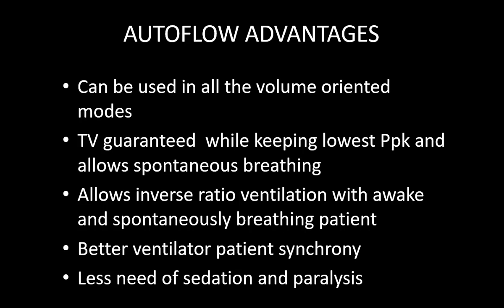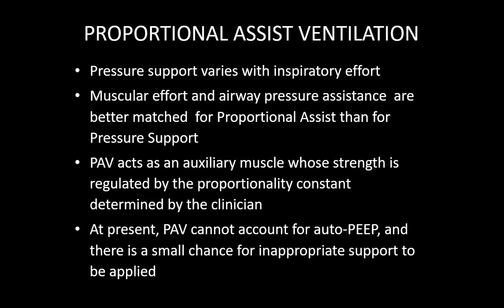So it can be used in all volume oriented breaths, tidal volume guaranteed while keeping the lowest peak pressure. It allows spontaneous breathing, allows inverse ratio ventilation with an awake and spontaneously breathing patient, gives better ventilator patient synchrony, and less need of sedation and paralysis. Next entity is proportional assist ventilation.